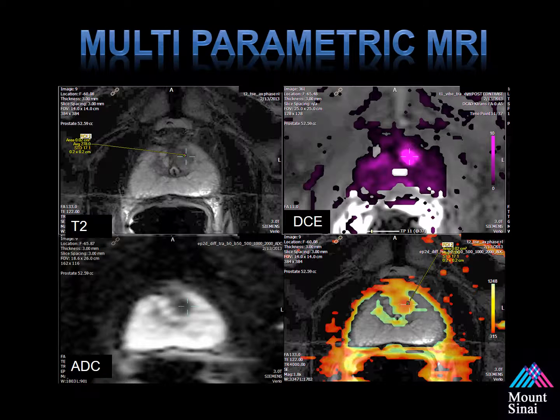This is an example of the case shown earlier, with the remaining sequences displayed here. In the upper left corner is the T2-weighted sequence. On the right is dynamic contrast-enhanced MRI — a color overlay showing increased uptake in the left anterior lesion. In the lower left corner is the ADC map — apparent diffusion coefficient — which shows an area of restriction as dark signal. On the right is a color map outlining the ADC values within the lesion.